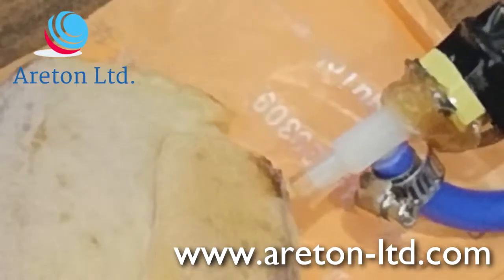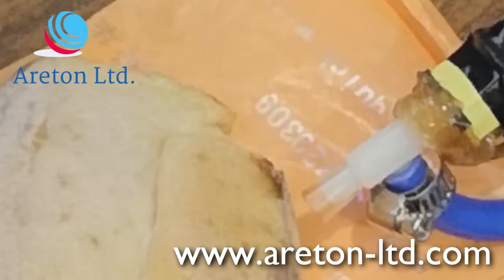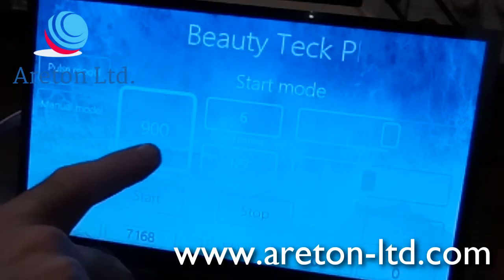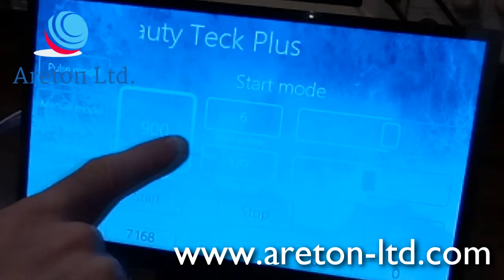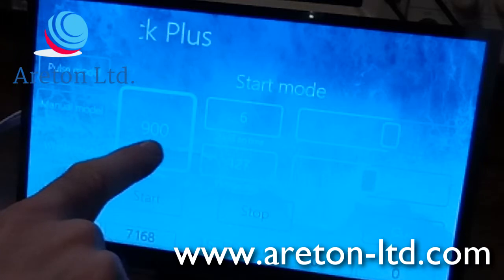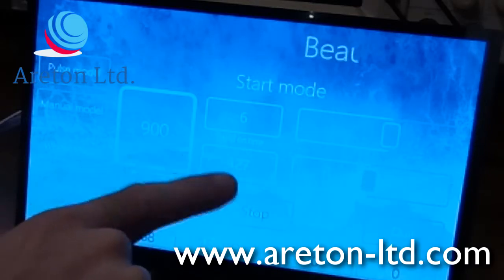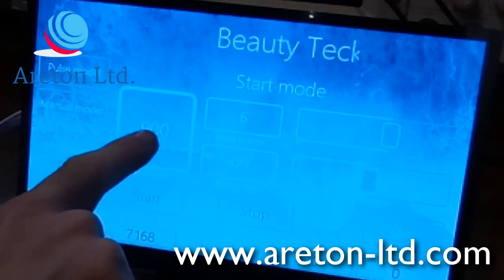Now basically what I'm doing, I've actually managed to set it up. At the moment I've got the argon gas off. What I told the device is, keep the tip on for 900 milliseconds in start mode, in the start function, and then once you switch off the tip, wait for 6 seconds before you switch it back on again. That's what I'm telling it. That's the voltage step, which we're going to cover in other videos. I've chosen this just to be the same as in the videos, as we talked about.